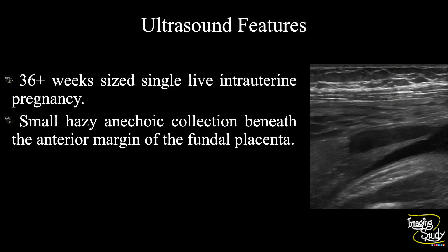In summary, a 36-week-sized single live intrauterine pregnancy is seen with cephalic presentation and adequate liquor. A small amount of hypo- to anechoic collection is noted beneath the anterior margin of the fundal placenta, indicating retroplacental hematoma.